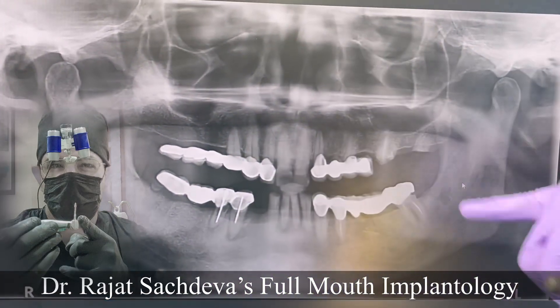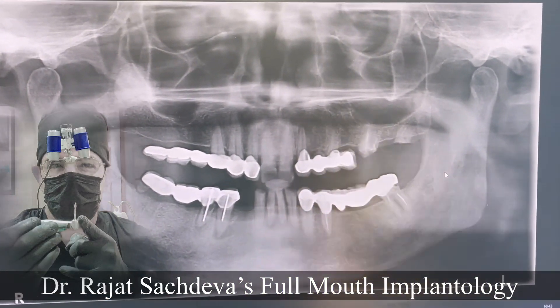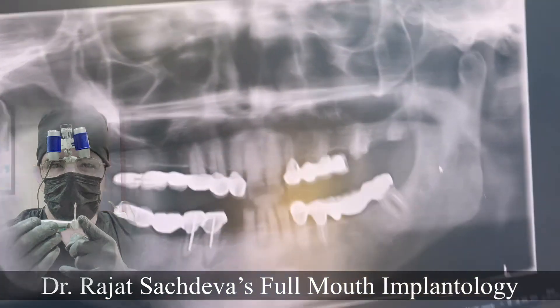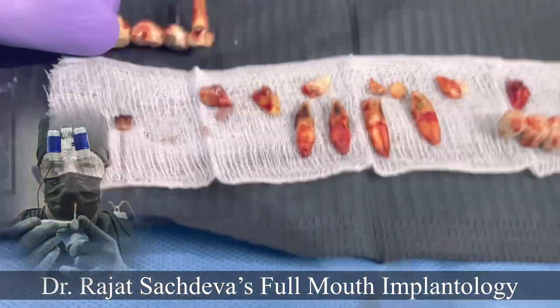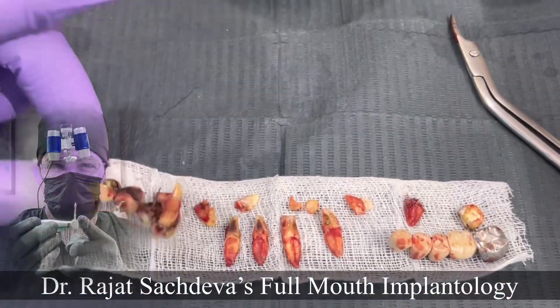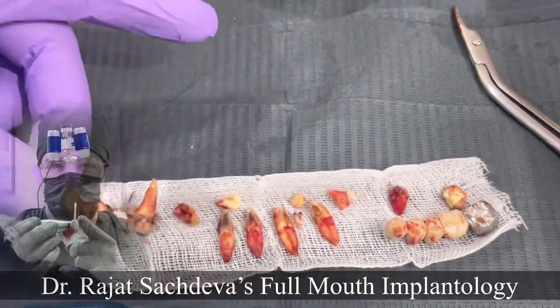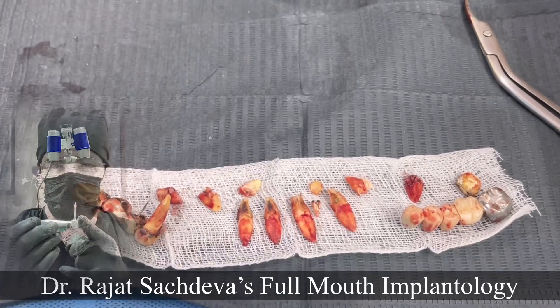Make sure that the extractions are atraumatic. With photodynamic therapy, you have to be able to remove any infection. You can see here the faulty bridges, and the other teeth will be removed as well.